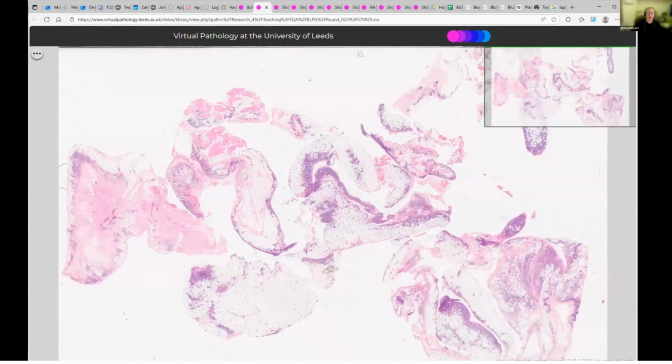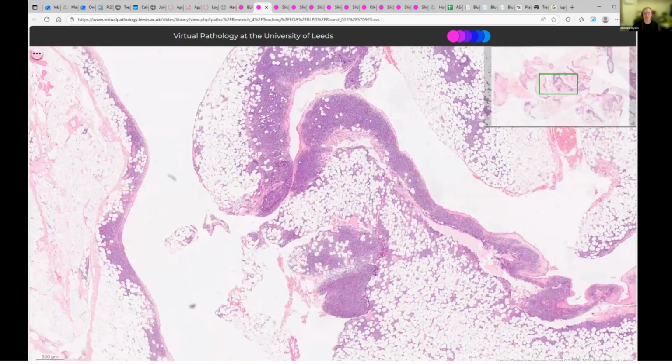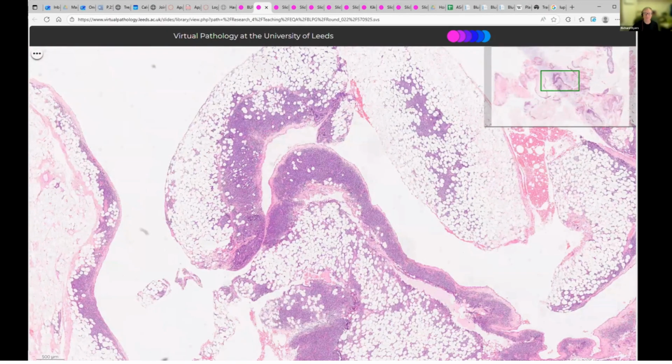And what we've got is lots of pleural tissue. Of course, I'm not an expert in cardiothoracic pathology, unlike my colleague from last week. So it all looks the same to me, except obviously there are lymphoid cells here, and it is in a lymphoid area. So we're thinking that this might be some lymphoid lesion.